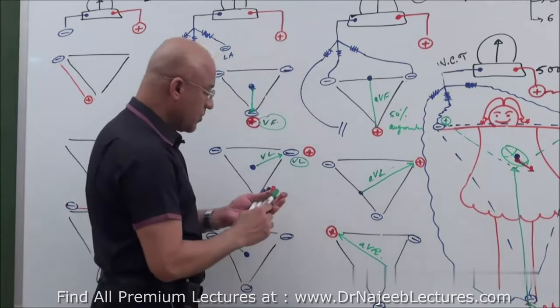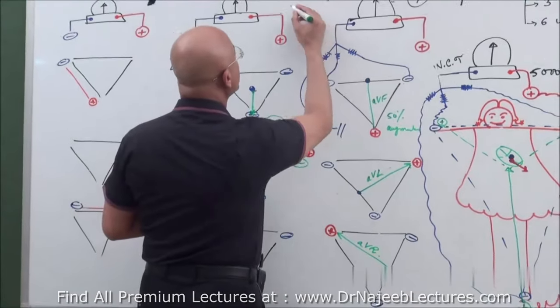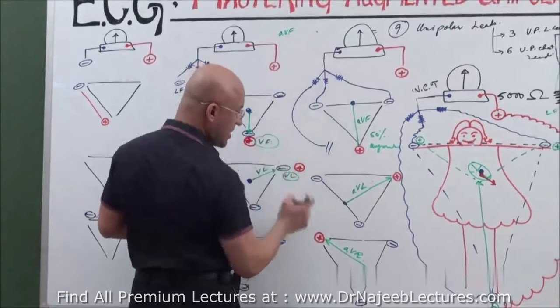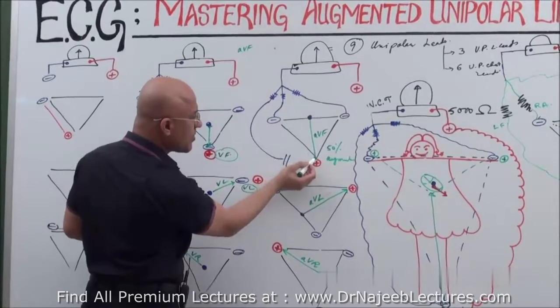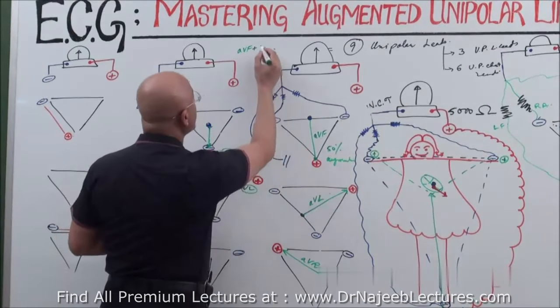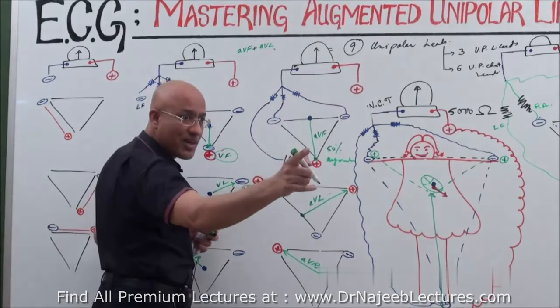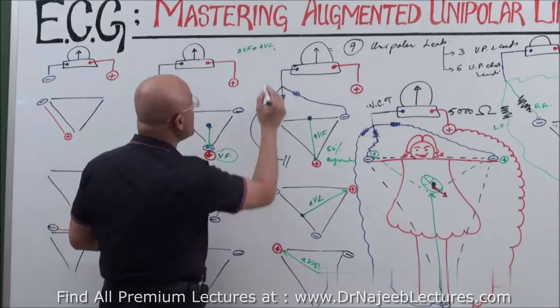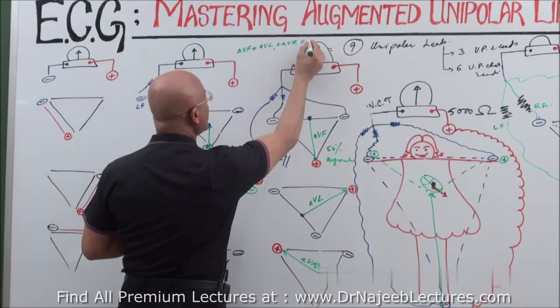Now let me tell you that the voltage which is recorded from AVF, what is this? AVF is from here, right? Plus voltage from AVL, because these are positive electrode voltages, and voltage from AVR. All of them, when you add together, it will become zero.